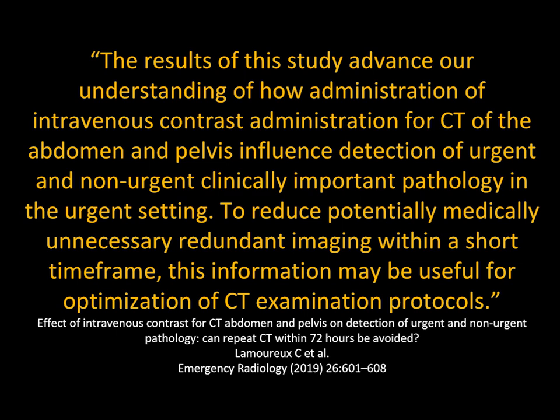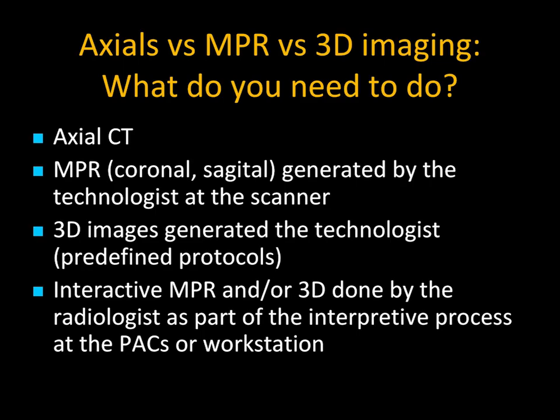Why miss something? You can miss pyelonephritis. You could miss parenchymal liver disease and possible infection. You can miss early pancreatitis. You can miss thrombus in vessels. You can miss an infinite number of things. IV contrast, as we've just discussed, is safe. Creatinine levels 1.8, 1.9 are no problem. GFR is above 30, no problem. Why make things into a problem? If you're doing CT, take advantage of the quality and the information CT can offer.